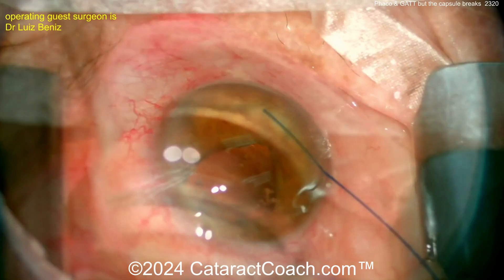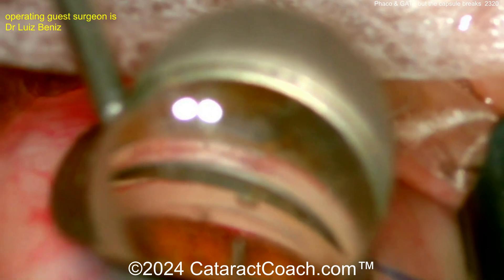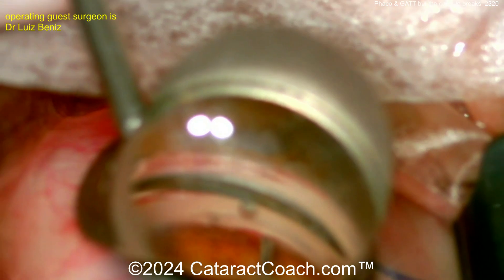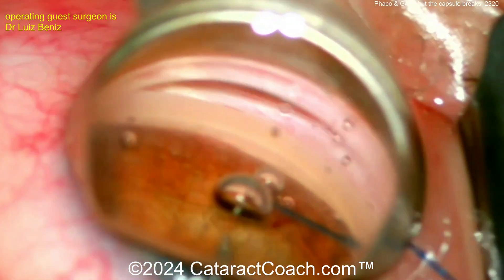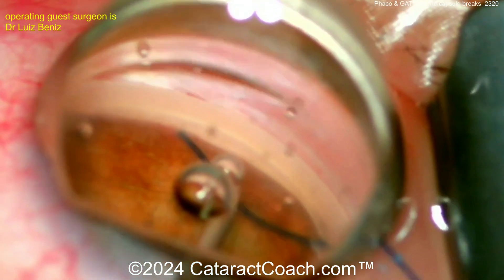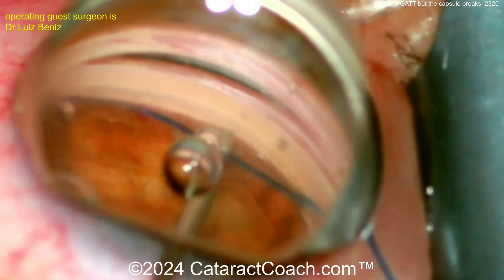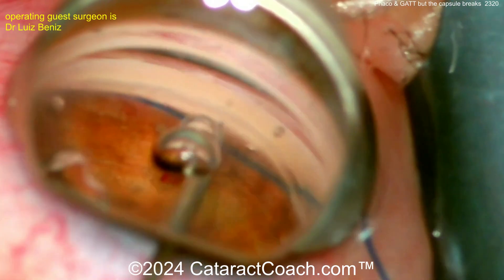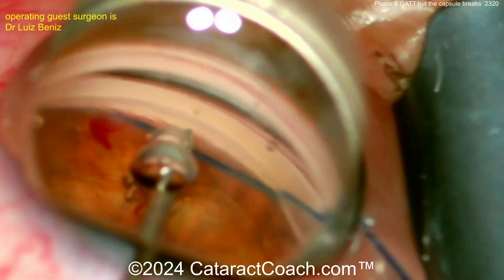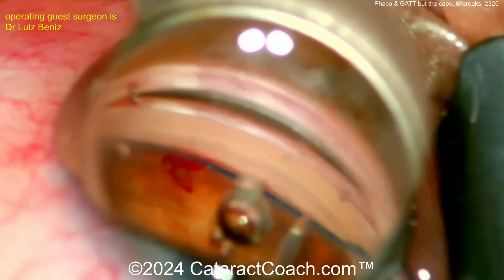Now here comes the GATT — G-A-T-T. That's a prolene suture, typically 6-0 prolene, sometimes smaller. You can see the end has been slightly cauterized using a needle to create an entry point, and then slowly threading that prolene suture into the trabecular meshwork. This can go around 360 degrees. The surgeon is going to do a great job — you'll be surprised at how beautifully it flows right through. You'll get it to come around a full 360, pull both ends out, and you've created your trabeculotomy.